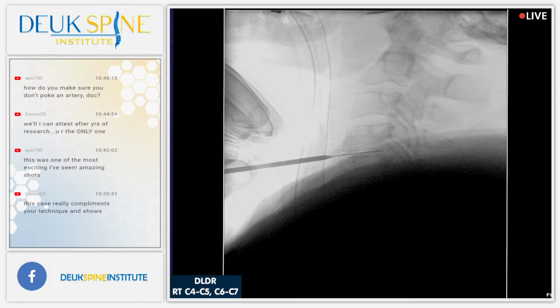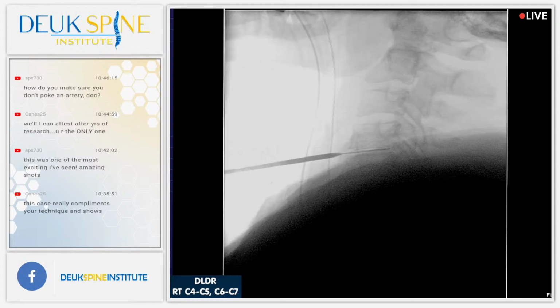So yes, it is a really, really cool surgery, which is why I have Henry saving it for me so I can go back and look at it later. It's kind of like watching your kids on video, you know, as they grow up. You take pictures of them and videos, you go back and look at the family picture book. I like to go back and look at the herniation picture book.